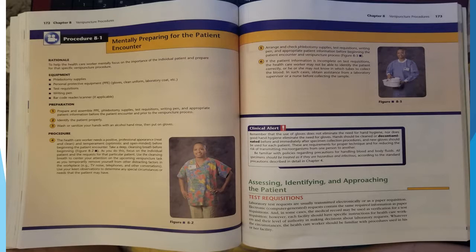Step 5, arrange and check phlebotomy supplies, test requisitions, writing pen, and appropriate patient information before beginning the patient encounter and venipuncture process. Step 6, if the patient information is incomplete on test requisitions, the healthcare worker may not be able to identify the patient correctly, or he or she may not know in which tubes to collect the blood. In such case, obtain assistance from a laboratory supervisor or a nurse before collecting a sample.